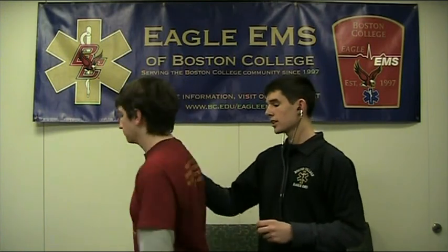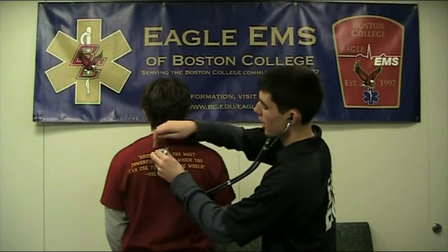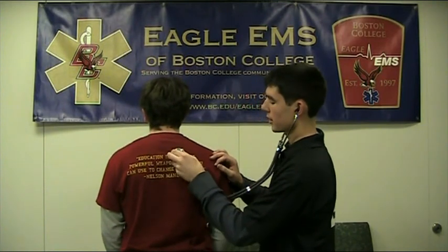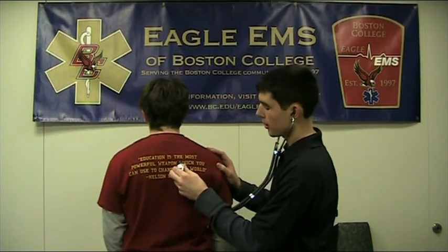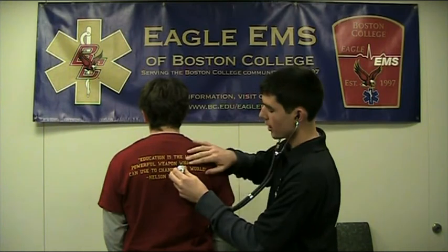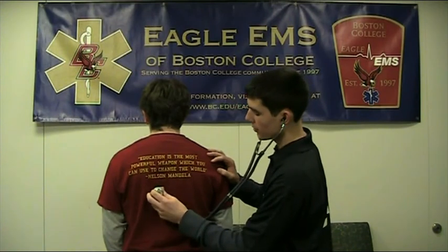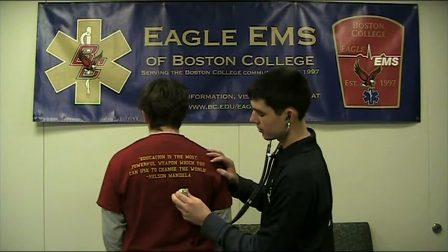Also, be sure to listen to the patient's lung sounds on the back. You should start again at the upper field and be careful not to go over the patient's scapula so that you can listen clearly. Make sure you do it on the other side. To listen to the middle field, go lower on the patient's back — not over the scapula — and get the other side. Finally, assess the lower field by going lower on the back, getting both sides. You can also add additional fields if necessary. That is how you primarily and accurately assess a patient's lung sounds.